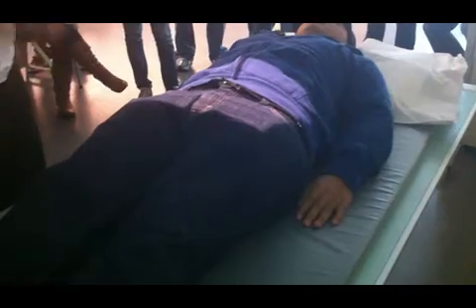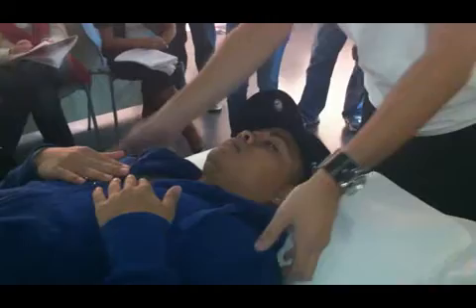Okay, so on the table, just bring your hands up on your chest. You want to make sure he's in the middle of the table. Okay? So if you look at him, he's lying at a little bit of a diagonal angle. Okay? So you can either adjust the pad that he's on, or you can just move him over so he's in the correct position here. So let's move this leg out a little bit. Move your shoulders over a tiny bit. Eyes a little bit more aligned on the table.